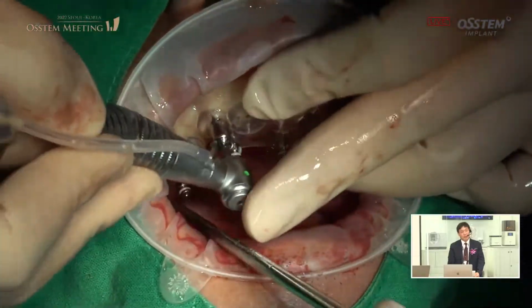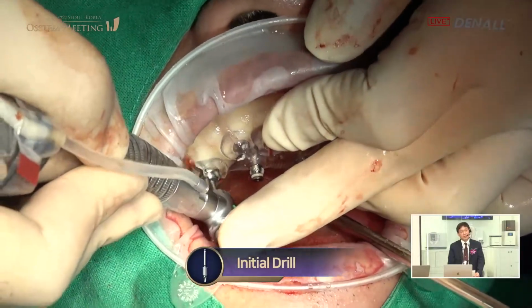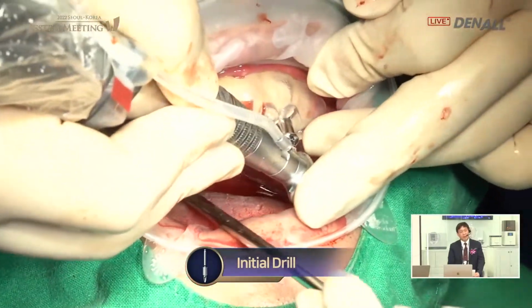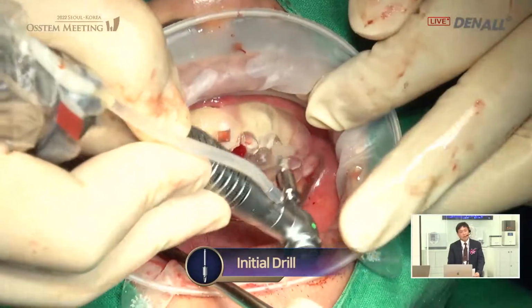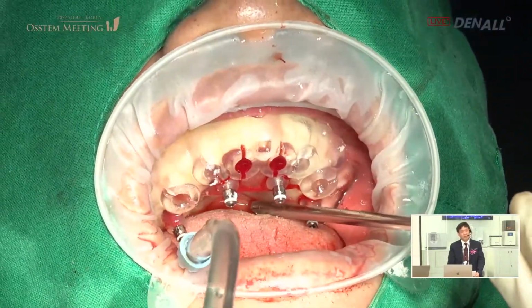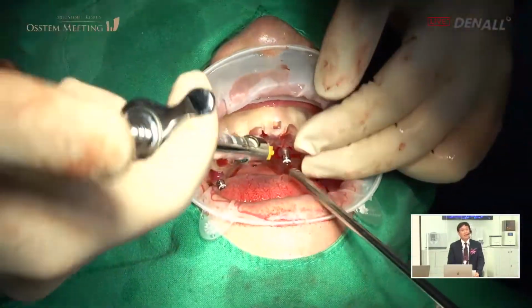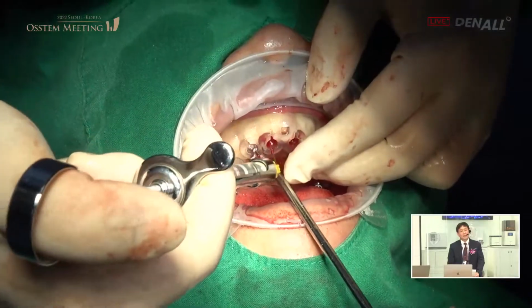So do you feel any pain? Is it painful? So the flattening drill is used, and now the initial drill. So I need to inject the anesthesia. The patient seems to feel pain.